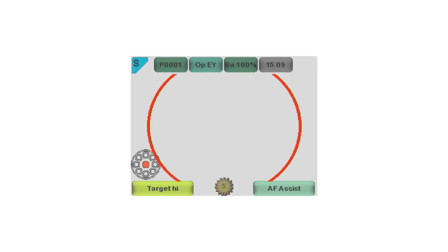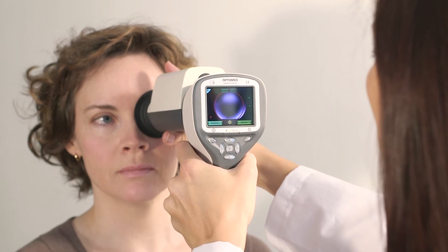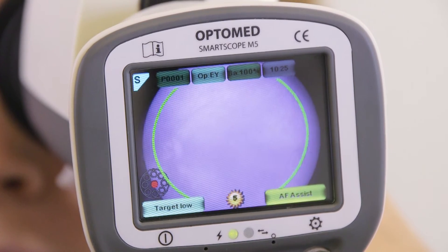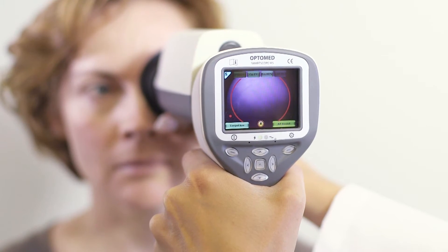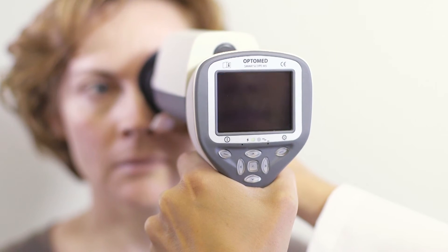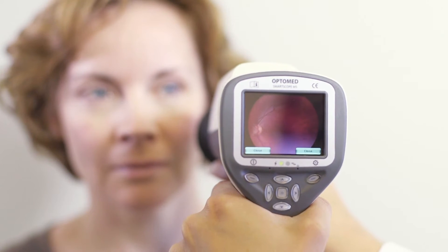Select preferred focus mode by short pressing the right soft key. Assist mode is active by default. When the shutter button is pressed to the first position, the camera will start focusing once the retina is fully in view and the aim help circle has turned green. If the user or patient moves during focusing, the camera will restart focusing until good focus is found. The image is taken automatically when the aim help circle turns green. This mode enables full automatic imaging but works best only with cooperative patients.